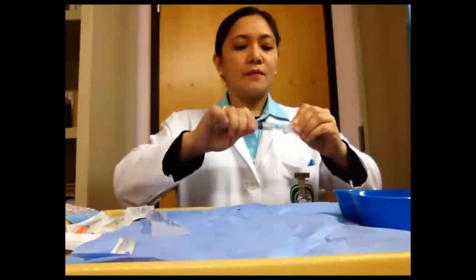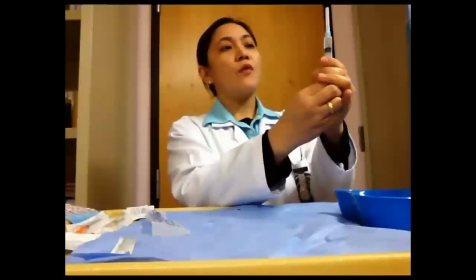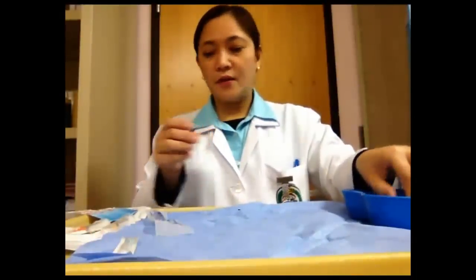Okay, secure it with the syringe. Tap the syringe and remove some bubbles or air. Allow 1 drop of medication from the tip of the needle. Now, this 2 ml medication is ready for intramuscular injection. Of course, we need to prepare alcohol wipes to clean the patient's injection site and a Band-Aid to be applied on the patient's injection site after.